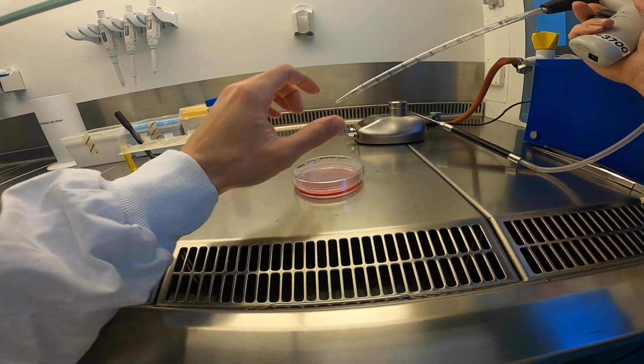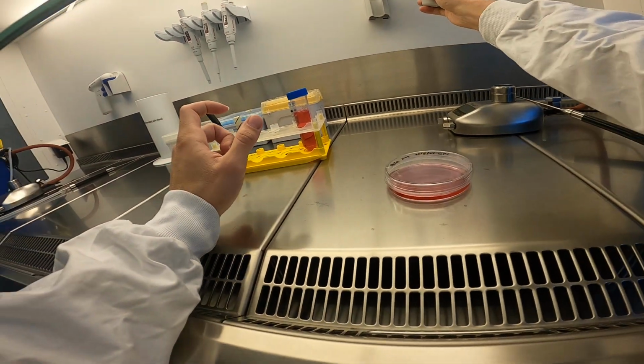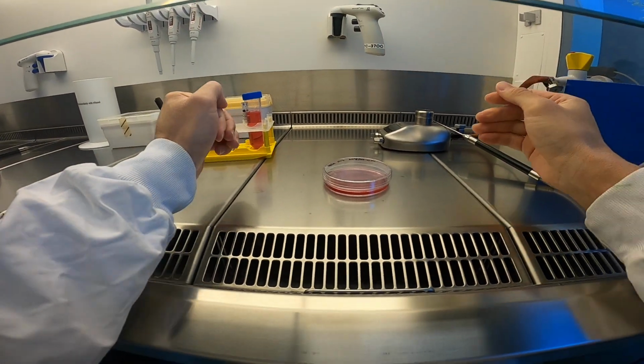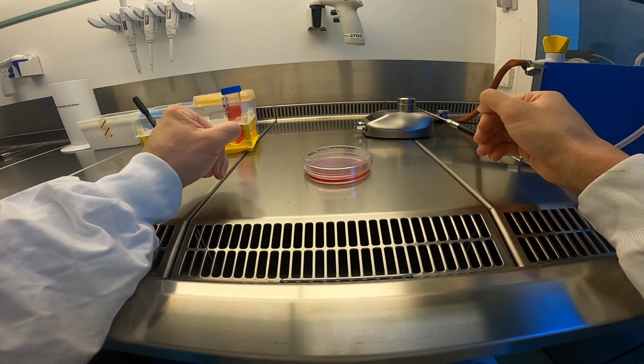So we put the plate lid back on, throw the pipette in the blue bin, and that's it. That's the appropriate way to remove and add media to our plate.